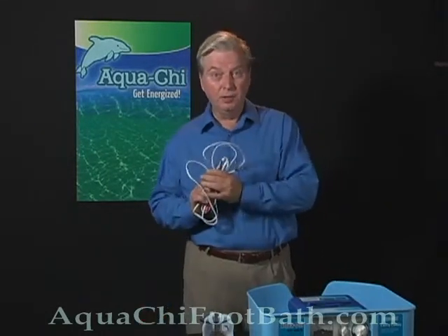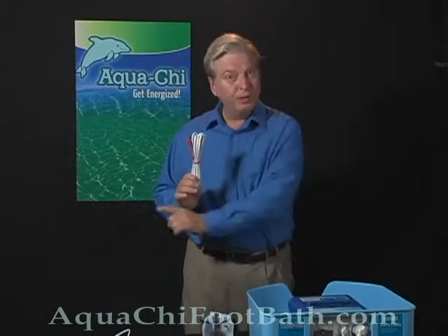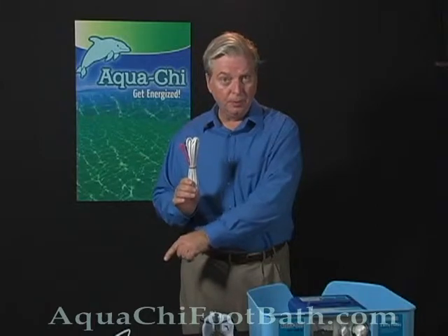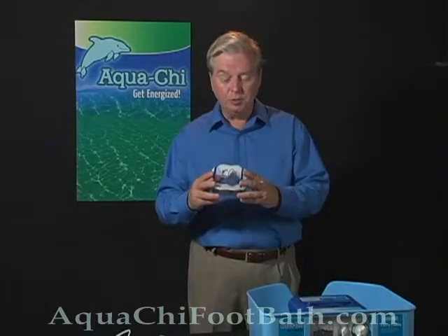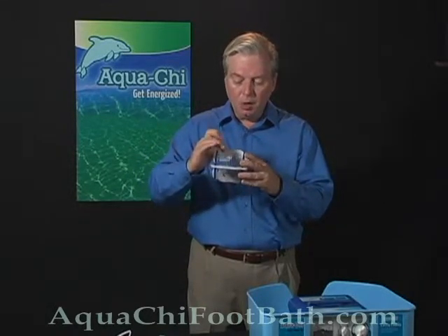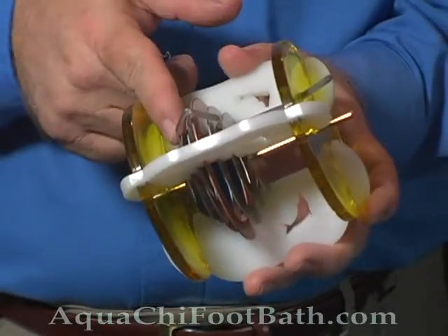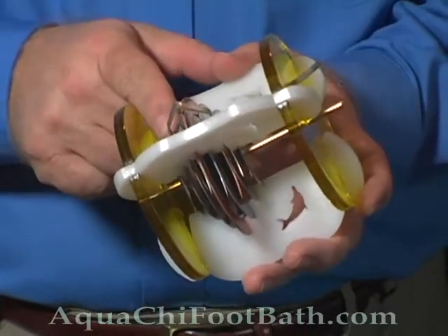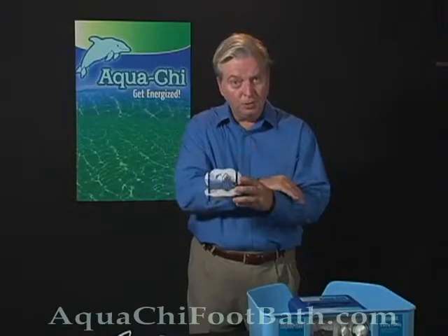So the next thing we're going to do is replace the old cable with the spare cable that came with your Aqua Chi, just in case there's a short in the original cable. The other thing we're going to do is examine very, very carefully the module. Look at this strip, the module strip. Make sure that the only rings that it is touching are the 2nd and the 6th, or the 2nd from the bottom, depending on how you look at it. If it's touching any other metal, this could blow a fuse.